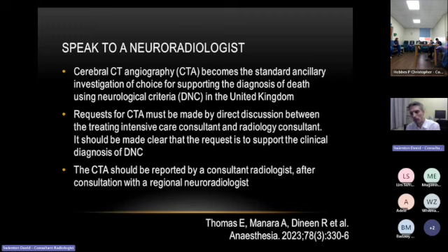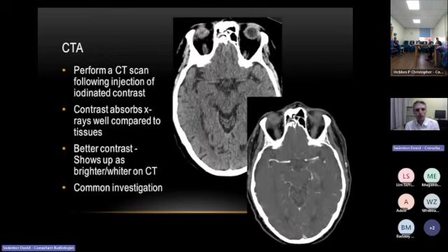And not an issue here, but potentially if you're in a centre without a neuroradiologist, they may wish to speak to a local neuroradiology colleague, and certainly speak to colleagues in centres with varying degrees of neuroradiology support. They may do that, or they may simply report together, so have 2 radiologists reporting that. And in fact, some centres will issue a dual report. You have 2 radiologists look at it. It really does vary. That's not the practice here. I think we're able to look at these in isolation.